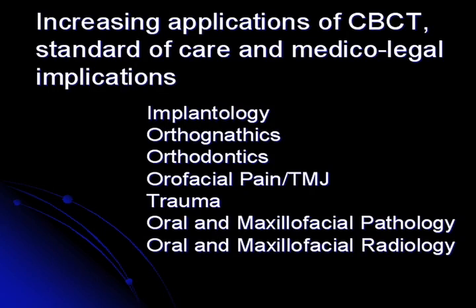The applications currently that are very significant are in implantology, orthognathic treatment and surgery, orthodontic treatment planning. At USC, for example, the orthodontic department really doesn't use lateral cephs anymore or any of these other images. They pretty much take one cone beam CT, and that volume allows them to do all the reconstructions that they need to do. And it's amazing for treatment planning for before and after, because there's software that you can show the patient, this is what you look like now, and this is what we plan to do, and this is what your facial profile and your teeth are going to look like afterwards. So it's really profound for treatment planning.